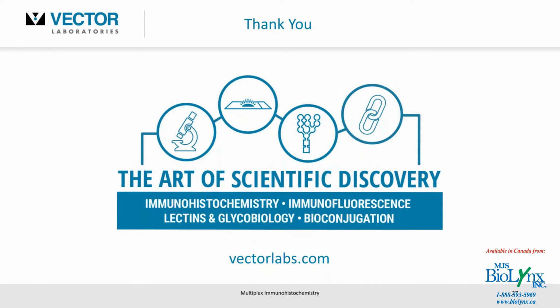I would say also that the chromogenic methodology still gives you a great idea of some of the underlying tissue architecture and morphology. You can see adjacent blood vessels or whatever it might be, cartilage, bone, things like that. Other structures might not be evident in immunofluorescence, and you might be only seeing half the picture with that, unless of course you did an adjacent H&E. But then again, not everyone has access to some of the filters or fluorescent microscopy in a given lab. Certainly, as I've shown, you can easily get started with the chromogenic methodology.